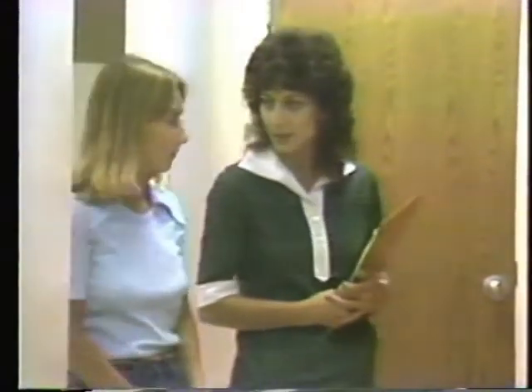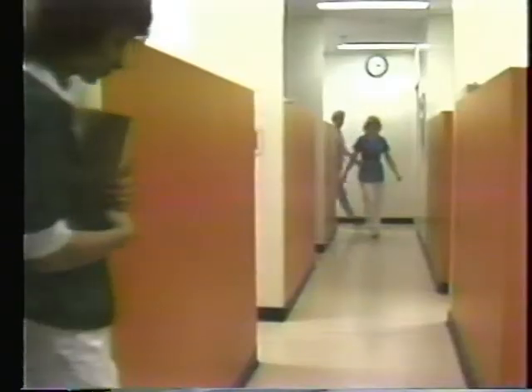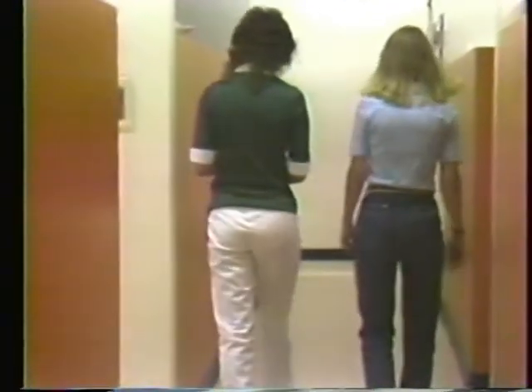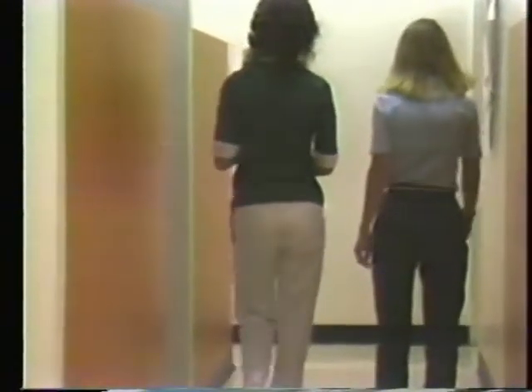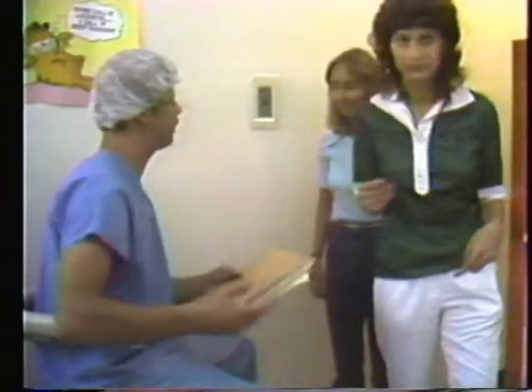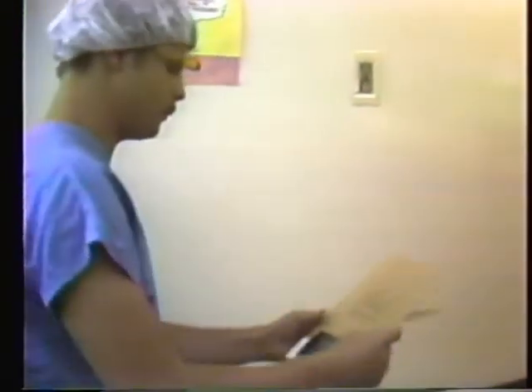Okay, Teresa, I'll take her back. Another important member of our clinic team is the dental assistant. The dental assistants will provide you with the instruments, equipment, and supplies you request for a procedure. Our dental assistants are also responsible for the cleanliness and asepsis of the treatment unit and the sterility of the instruments, clothing, and equipment within it. The assistant also accompanies the patient to the treatment unit, but normally does not work with you as a chairside assistant. Another student usually serves as a chairside assistant if you need one.